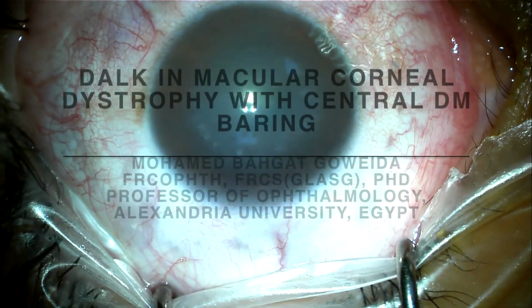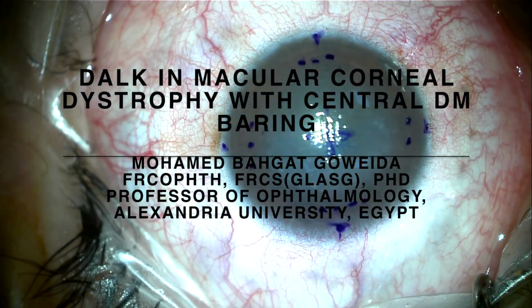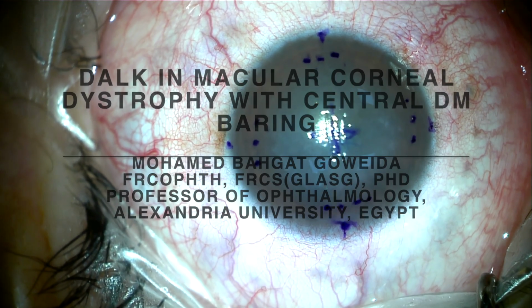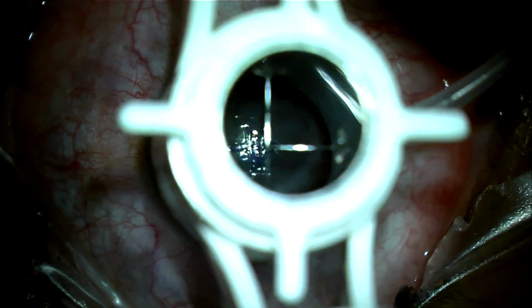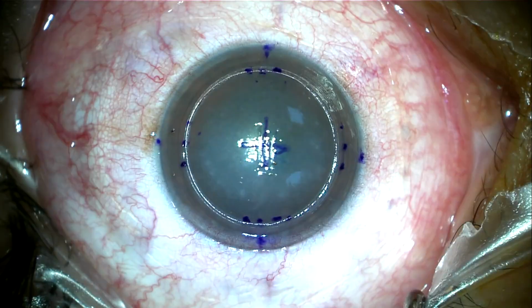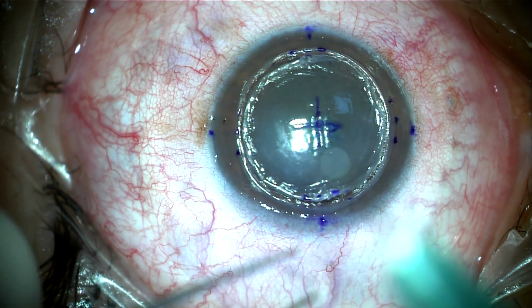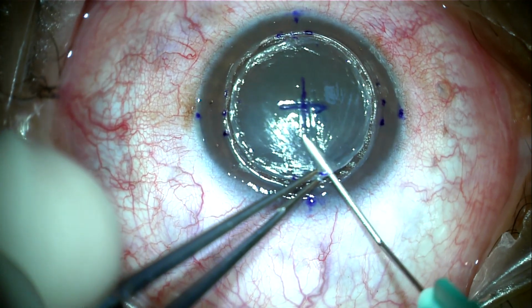Hello everybody, this is a case of macular corneal dystrophy, which is considered one of the very challenging cases to complete DALK. We start with the usual steps of marking the corneal center. Partial trephination is then done. Now I am introducing the insulin syringe to inject air in the stroma, aiming for a big bubble.